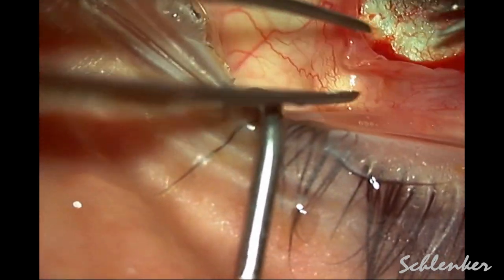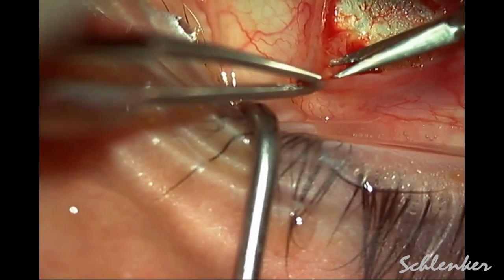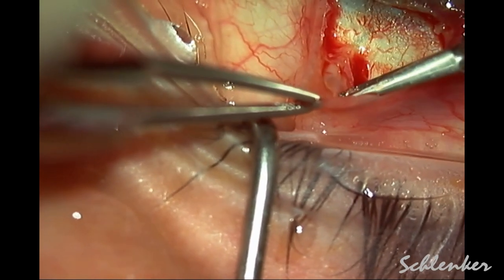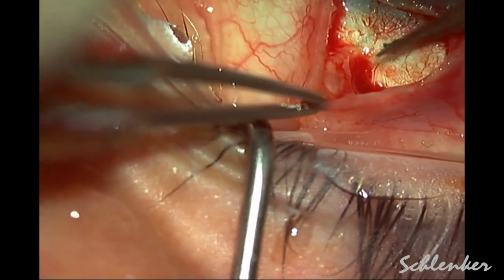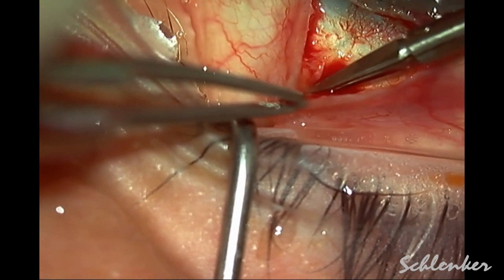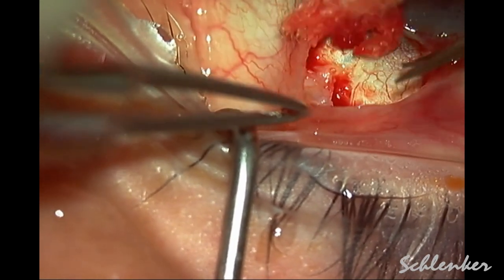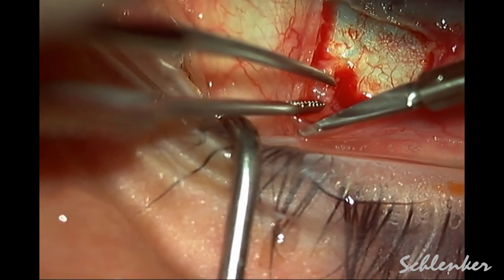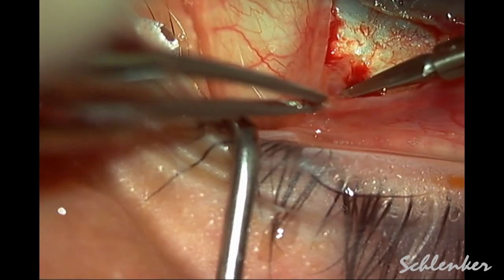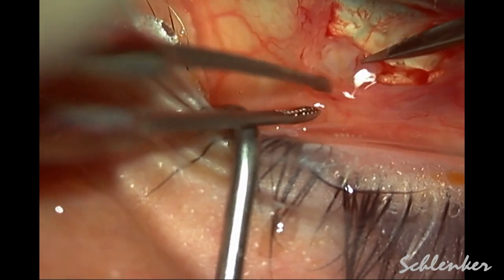We are trying to obtain a scleral plane, making sure that Tenon's and the Xen are retracted back, and then trying to mobilize this encysted area. We know that tube shunts can often go into a hypertensive phase and aqueous flow and the stretching associated with it can lead to significant fibrous encapsulation. This is just a fairly extreme example of the same phenomenon happening with the Xen micro stent.